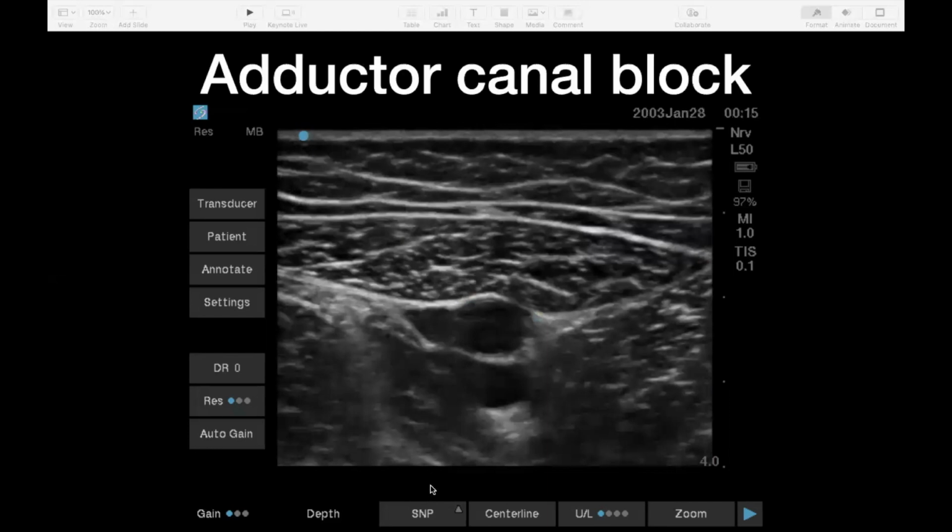It's another picture, just a nice illustration of the adductor canal in a different leg. It again maybe illustrates that in this fascial plane where you're tempted to bring the needle, that little structure there could be a nerve. That could be nerve to vastus medialis. It might be a small vessel. So again, probably worth avoiding that plane and coming in either underneath or above through the muscle.